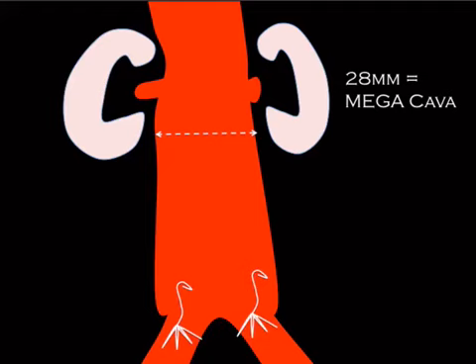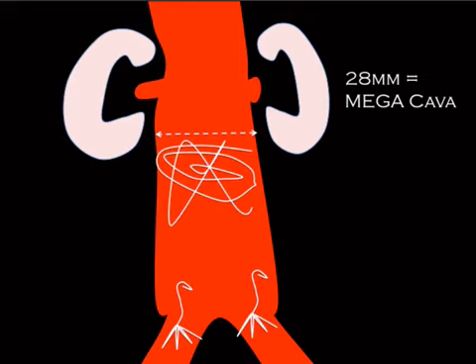But the probably classic answer is that you can put a bird's nest filter, which is a different kind of filter that looks like a bird's nest. You can use that all the way up to 40 millimeters. Okay, so that's the end of this IR talk.